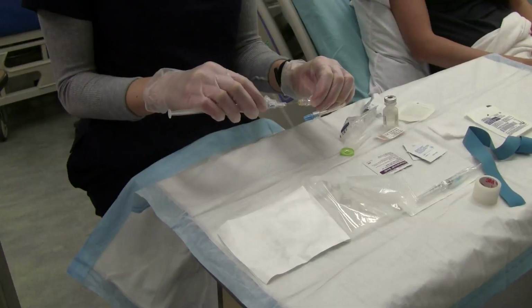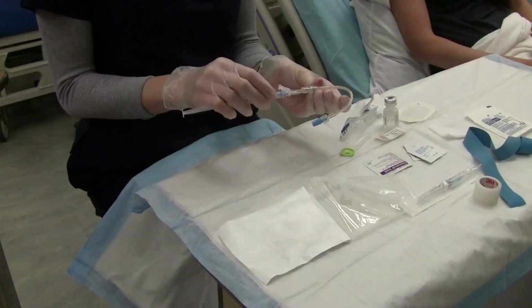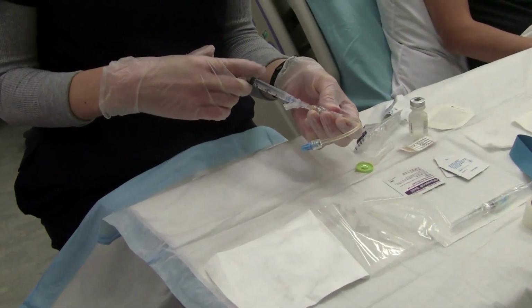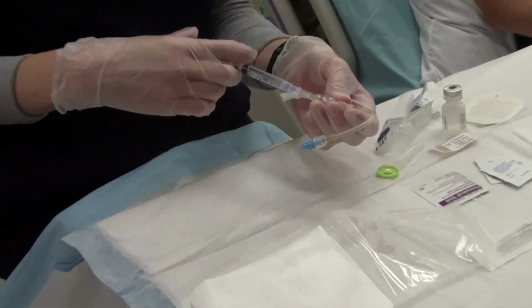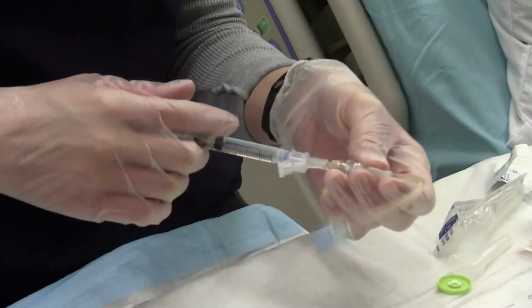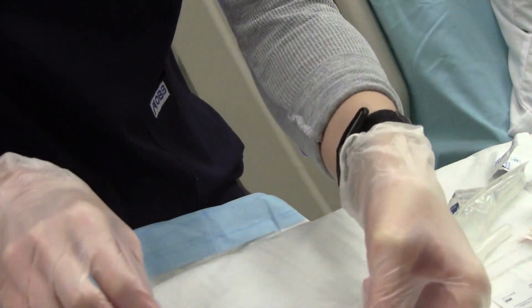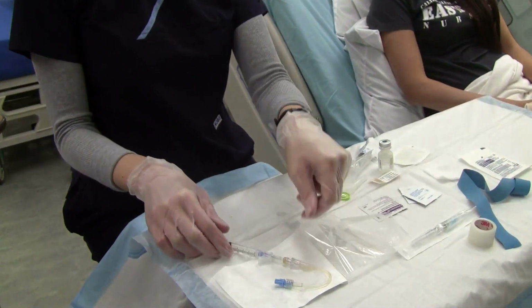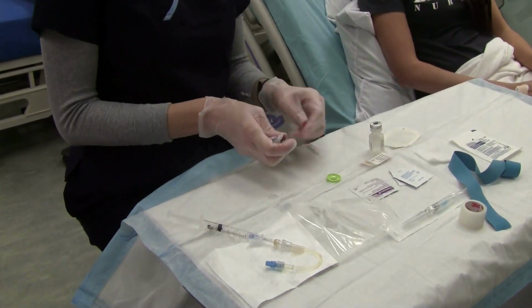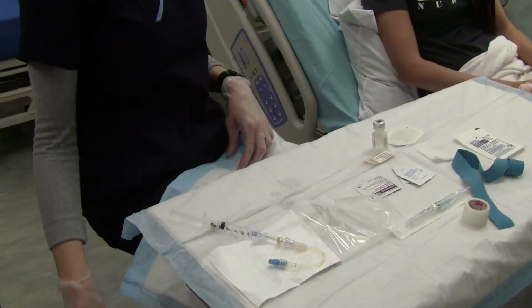Instill normal saline into the IV extension set or saline lock. Prepare your patient. Assist your patient to a comfortable position. Place a towel or a bed protector, such as the chucks, under the extremity to protect the linens.